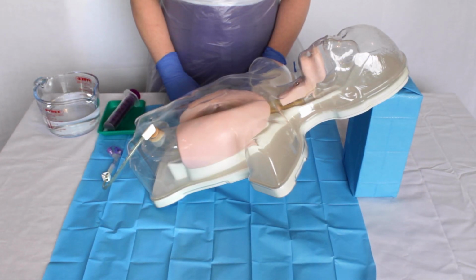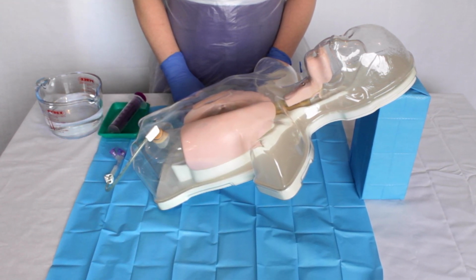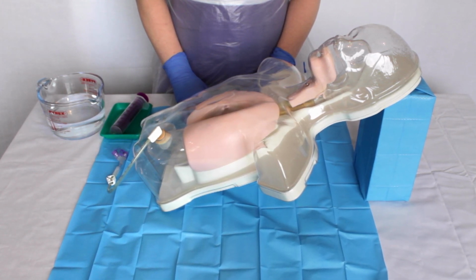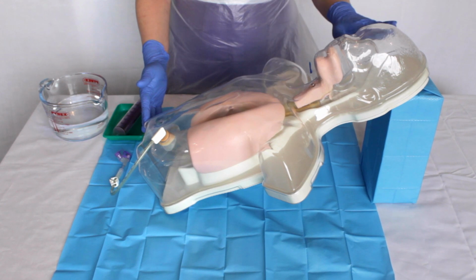There are two methods in which you can flush a feeding tube: the plunge method and the gravity method. Both will be demonstrated in this video. Ensure the patient is positioned comfortably at an angle of at least 30 to 45 degrees.